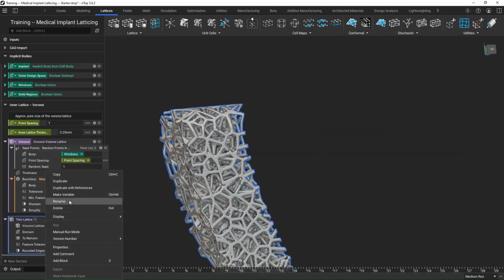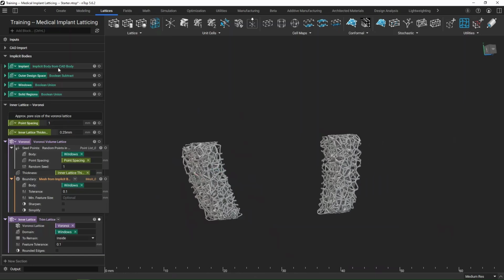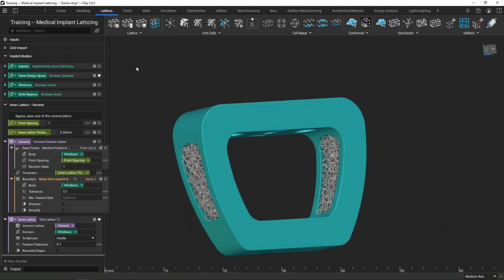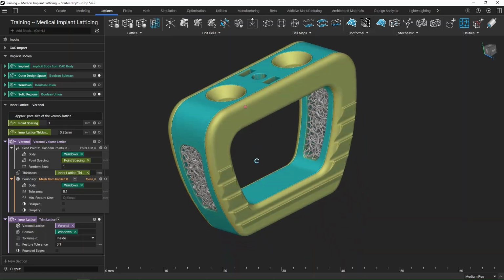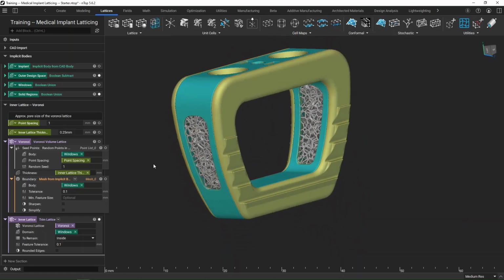So let me right click, make this a variable as well. We'll call this our inner lattice. And so if I go ahead, turn on that design space, turn on those solid regions, you can kind of see where we're headed from here. We have those nice windows that allow for that osseointegration. And now we can take it a step further to lightweight our implant even more.